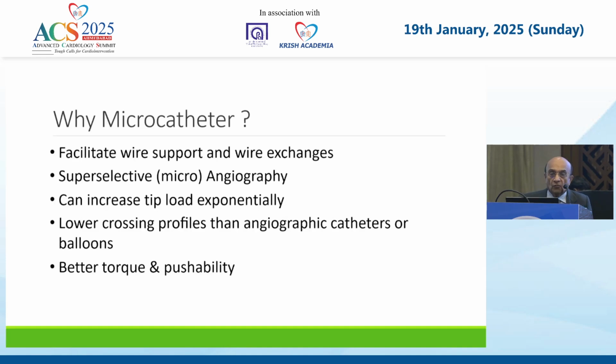All right. What does it do? It facilitates the wire and gives support. It gives you an opportunity to change the wire very easily, and you do not have to keep re-entering the coronary artery again and again. With a microcatheter, you can do a super selective angiography.